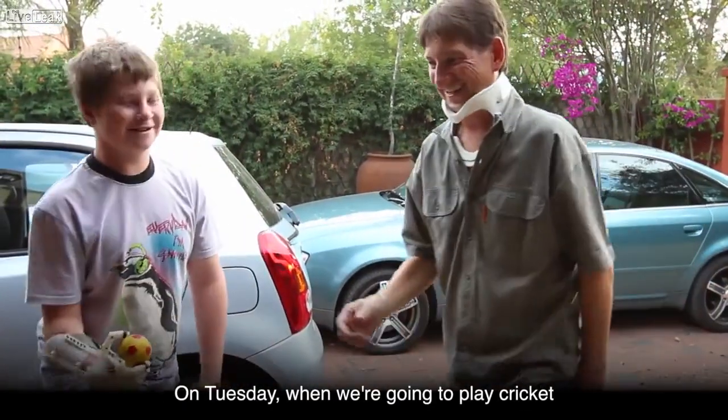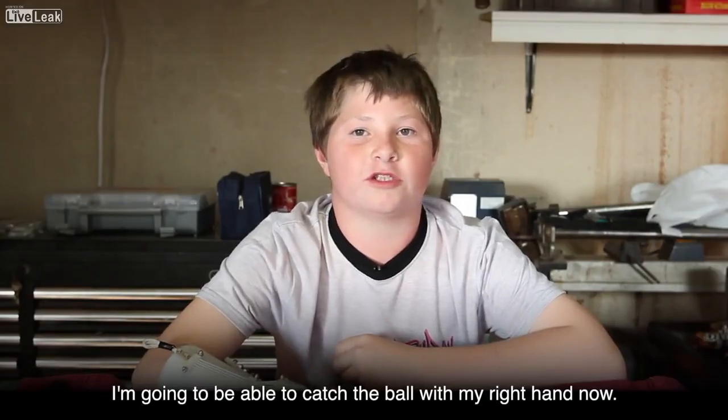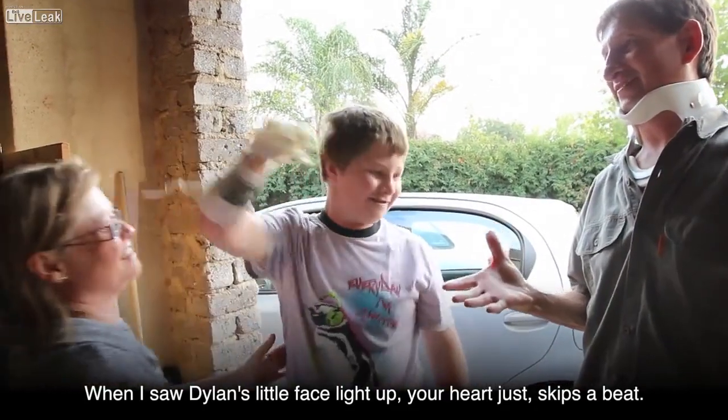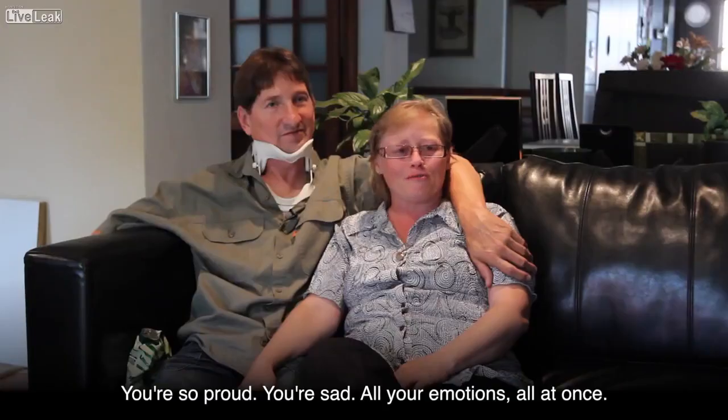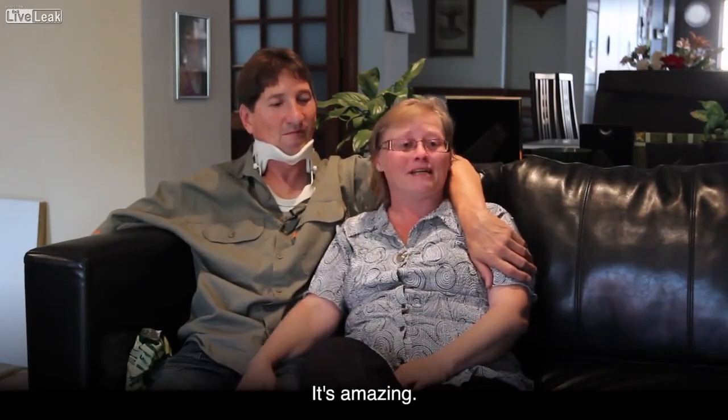I am quite excited about having a new hand. I'm excited to try cricket, golf, and go swimming with it. On Tuesday when we're going to play cricket, I'll be able to catch the ball with my right hand now. When I saw Dylan's little face light up, your heart just skips a beat — you're so proud, you're sad — all your emotions all at once. It's amazing.